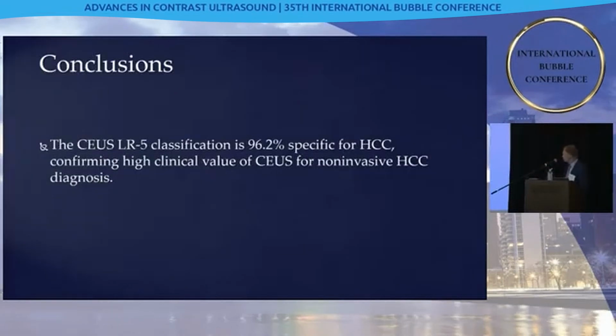So as a conclusion, I think contrast-enhanced ultrasound LI-RADS is a fantastic achievement, and I want to thank all people who were involved in designing this. It is fully integrated in the American College of Radiology LI-RADS category characterization. It has a fantastic specificity of 96%, very similar to MRI, and I think this confirms the very high clinical value of contrast-enhanced ultrasound in diagnosis of HCC.